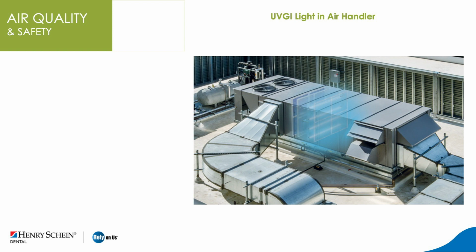In addition to filtration, UV light placed in air handling units can reduce or inactivate contaminated airborne particulates before air passes through the filter. UV light with shorter wavelengths is very effective in deactivating infectious aerosols. However, UV light is not commonly placed in commercial heating and air conditioning systems, and it's not very efficient in larger commercial systems. So if you're doing a 15 to 20 op office, it's probably not going to be very effective, because the air is moving so fast through the system.